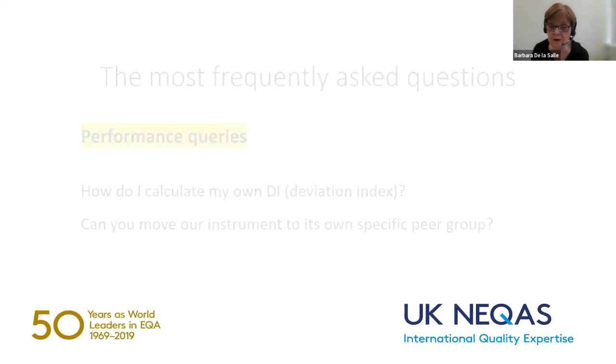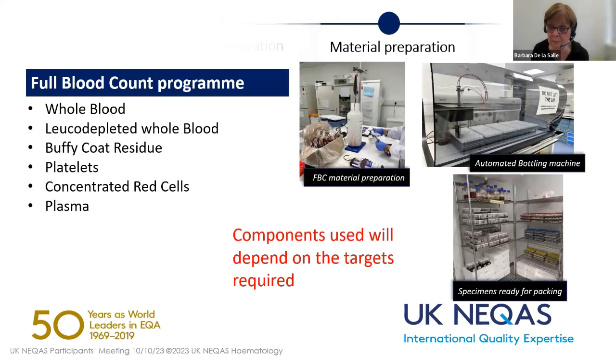But we do recognise, because of the way in which the material is prepared, that with the use of fixed material, it will affect how the full blood count material interacts with different instrument manufacturers and instrument reagents.